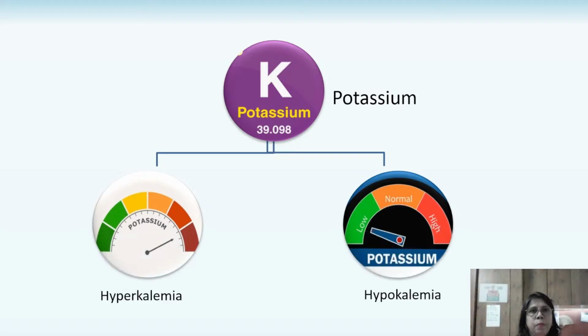Potassium levels need to be adjusted to remain in the physiological range and within the normal limits. In patients with hyperkalemia, sub-physiological potassium levels may be wanted. Also, in patients with severe gastrointestinal potassium losses, potassium supplementation may be required.